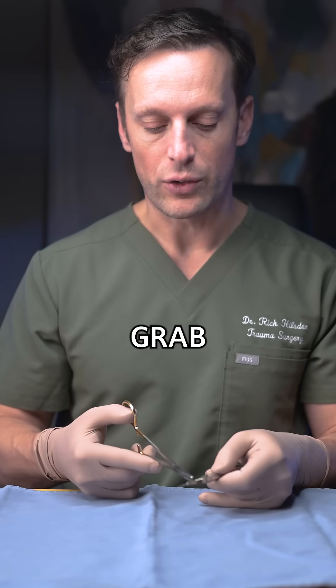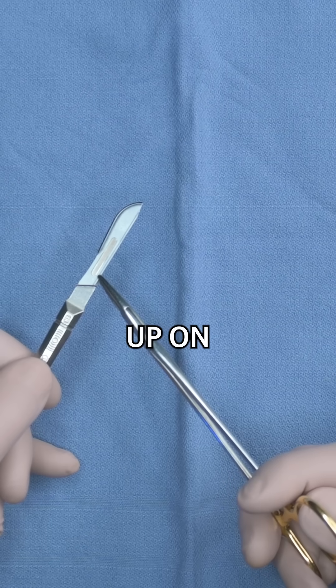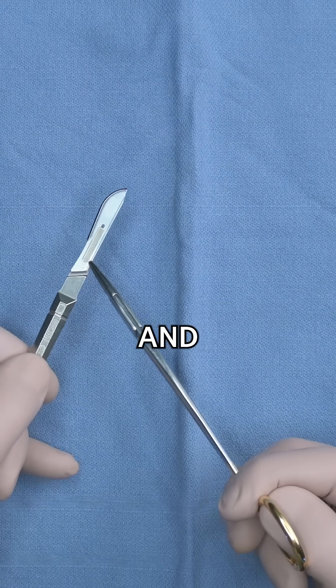To remove it, you grab the bottom edge, pull up on the back of the scalpel, and then slide it off.